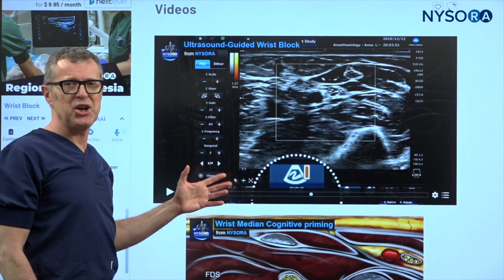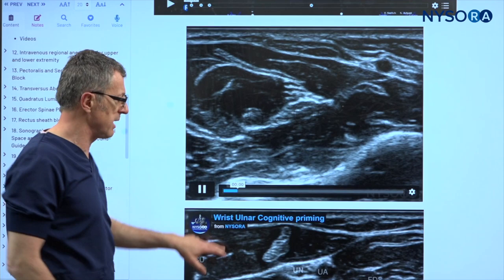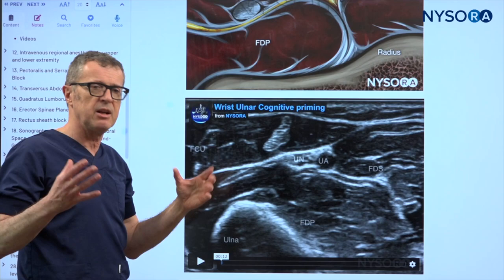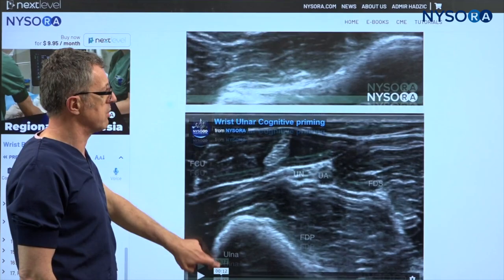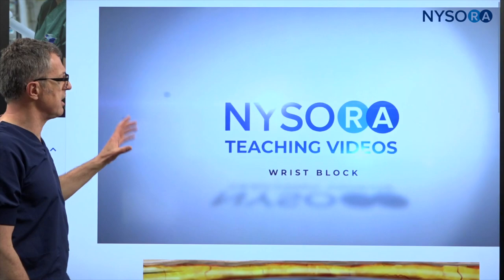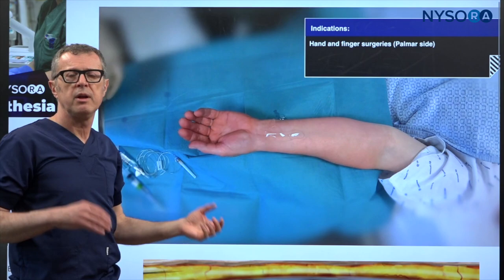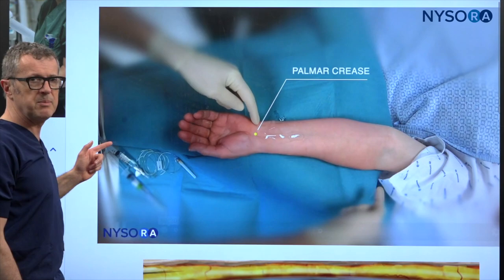Let's now watch the video of the entire procedure. At the end of this section on Next Level NYSORA, we have a section with videos — the video of the block performance, more videos on reverse ultrasound anatomy, and cognitive priming videos that help us understand the principles of these approaches. The video shows the position of the patient for the wrist block — really a forearm block, or the block of the median, ulnar, and superficial radial nerves.